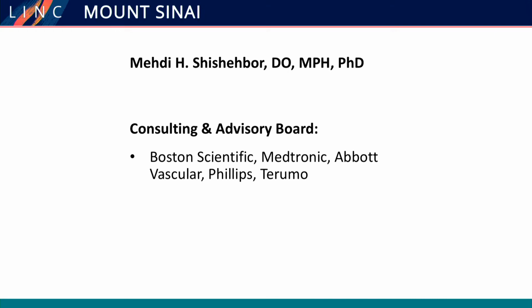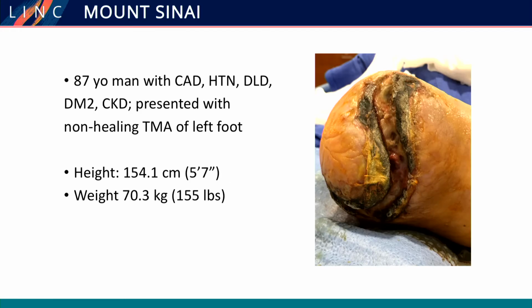I think the last case by Andre showing you all the different techniques to get reentry really summarized my talk. So this is just a recap if you missed something. But I like to show this talk through a case, and we can talk through it so you see what is our mindset when we talk about reentry.